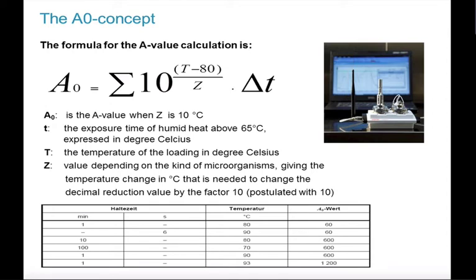But just very briefly, I'll explain to you that this disinfection value is actually your target, in order for you to get an indication whether your washer disinfection process is successful or not successful, or fail or pass.